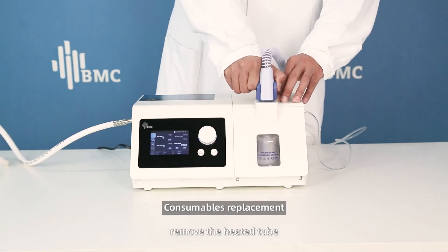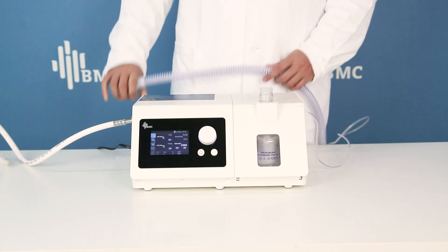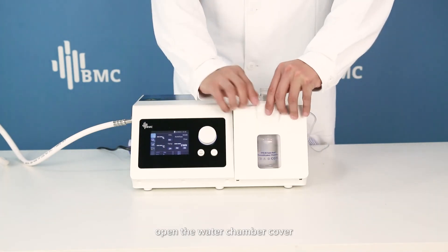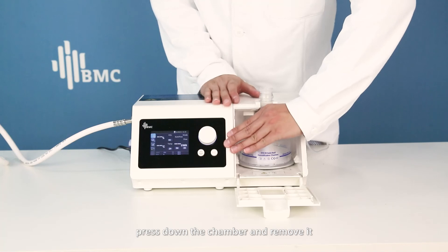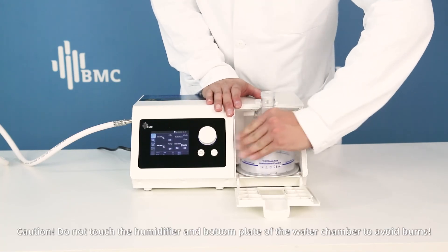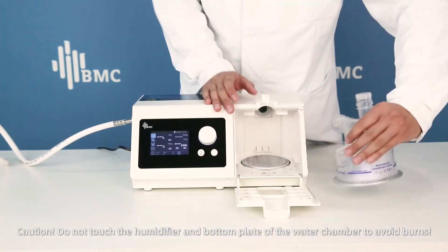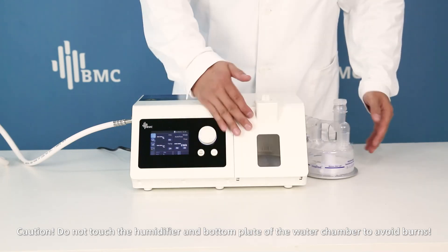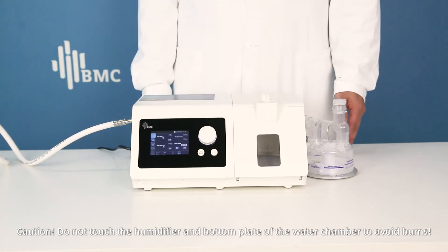Remove the heated tube. Open the water chamber cover, press down the chamber, and remove it. Caution: Do not touch the humidifier and bottom plate of the water chamber to avoid burns.